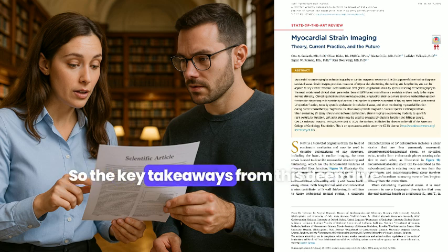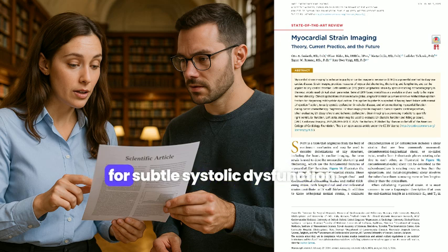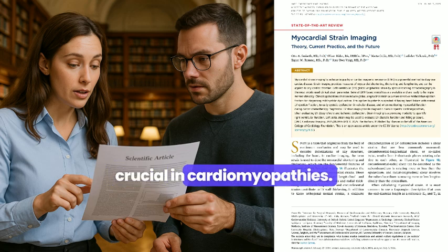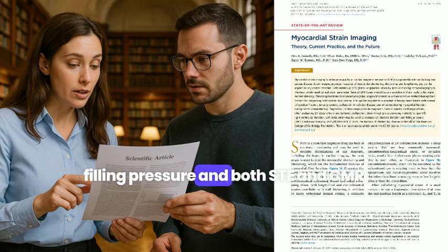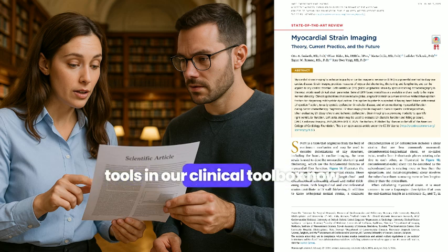So the key takeaways from this deep dive. I'd say LVGLS is your sensitive marker for subtle systolic dysfunction. Segmental strain patterns are crucial in cardiomyopathies. LA strain gives strong clues about LV filling pressure. And both STE and CMR strain are definitely ready and valuable tools in our clinical toolbox now.